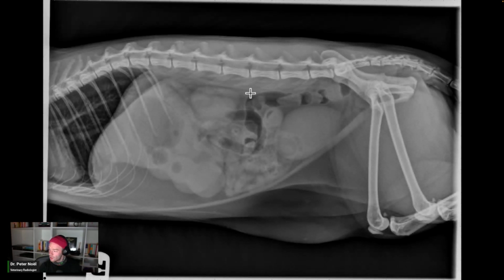The other thing that you could do, I think that would be very helpful, is you get a left lateral view. And if you get a left lateral view, you probably get the benefit of the doubt that a lot of this gas cap starts to dump into these. Okay. And so sometimes we'll get referrals for, there's a mass in the pylorus, there's a mass in the cranial abdomen. And yeah, that looks like a mass. But the reason you chill out is because that's part of the stomach and it's full of fluid, and maybe it's thick walled, maybe not, but it's at least full of fluid.